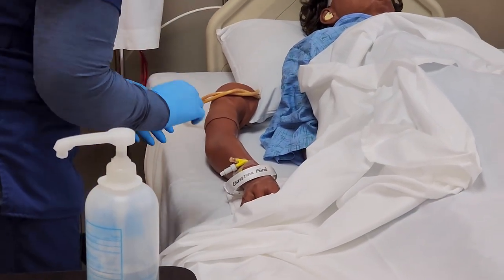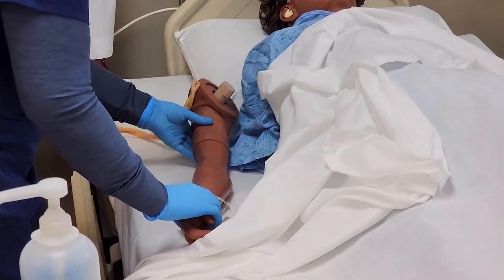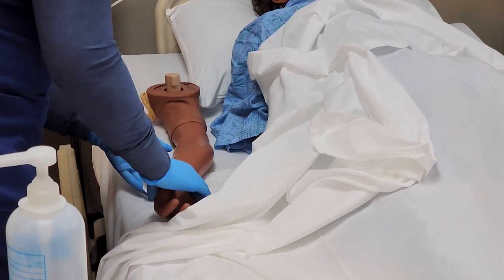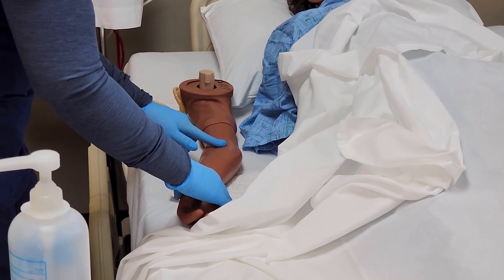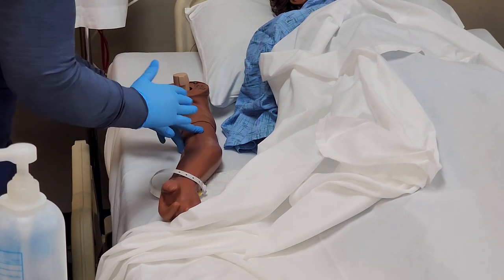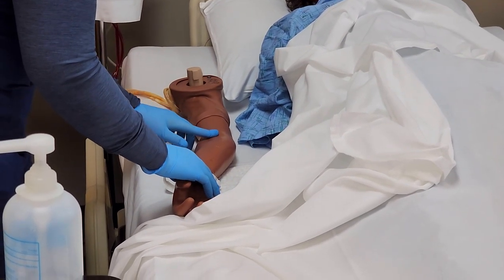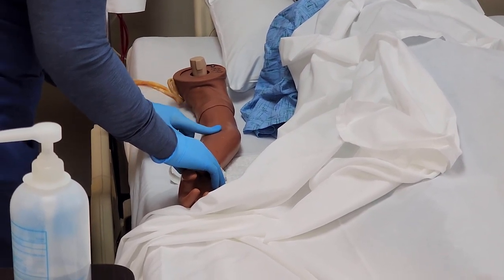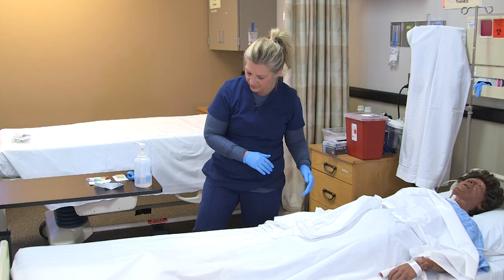Now I'm going to assess the site I'm going to draw blood from. The antecubital vein in this area is typically one of the most utilized sites because it's easy to see and access for plain venipuncture. I'm checking the vein — it feels soft and bouncy, and I don't feel any bumps or obstructions.